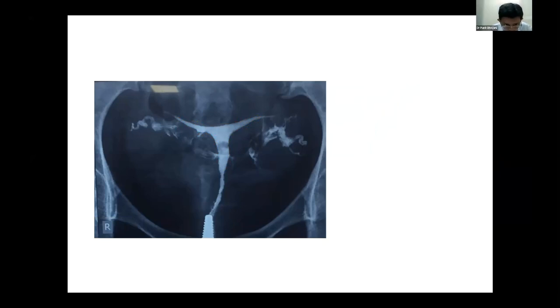Filling defect, a little bit, probably Ishita, this is what you are talking about. Not too sure. It could be just the initial phase. If we put in more dye, it might get opacified, or it could be a slight exposure issue. But mainly, this would also be the air bubble. But mainly, this is to show the shape.